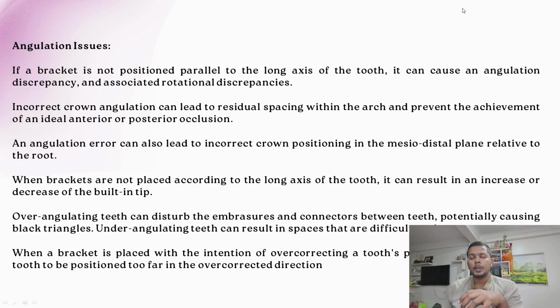When brackets are not placed according to the long axis of the tooth, this can result in an increase or decrease of the built-in tip. So there will be no or very little built-in tip.